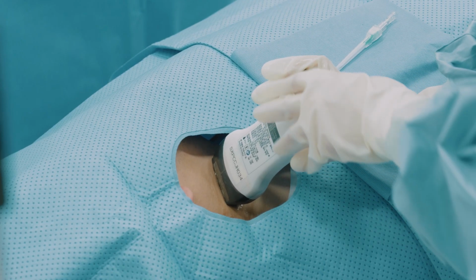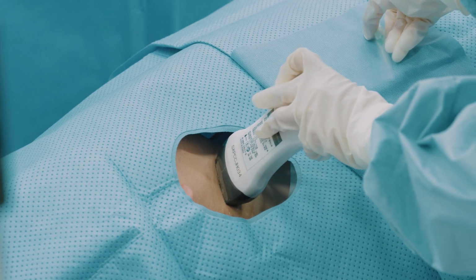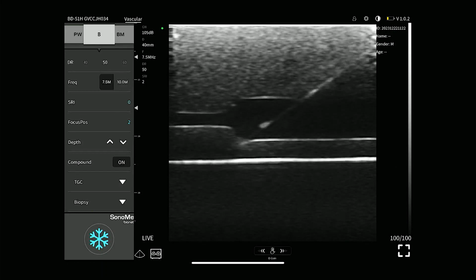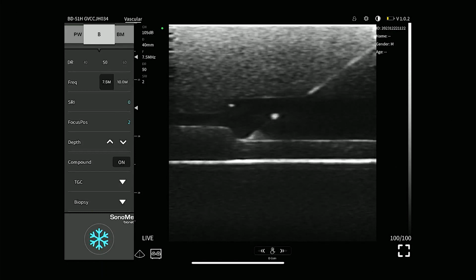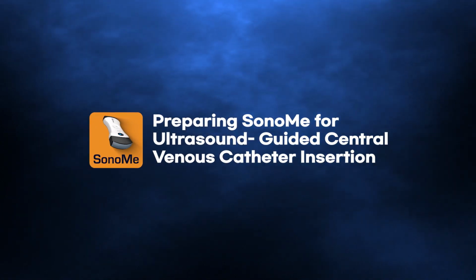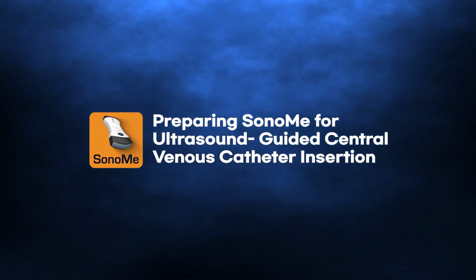Ultrasound guidance enhances the safety and precision of central venous access by providing real-time visualization, reducing complications during the procedure. Prepare for ultrasound-guided central venous insertion with the SonoMe dual-head transducer.